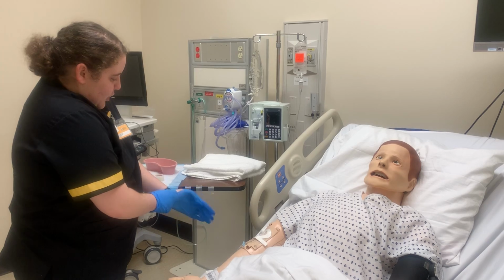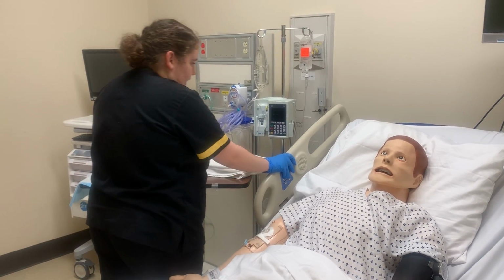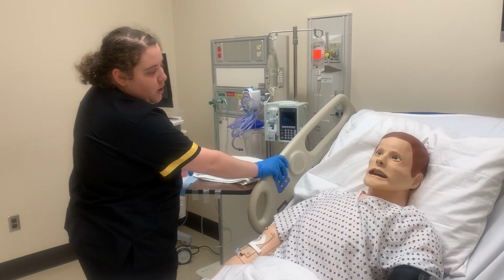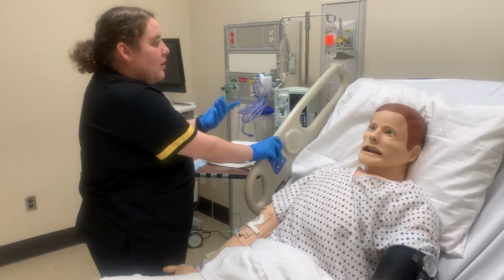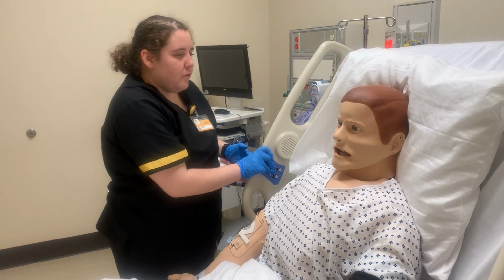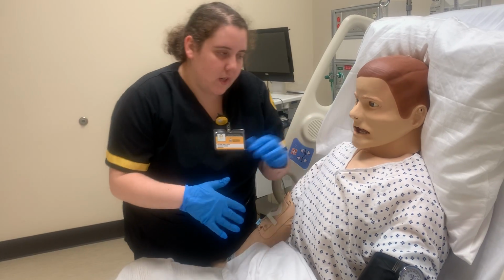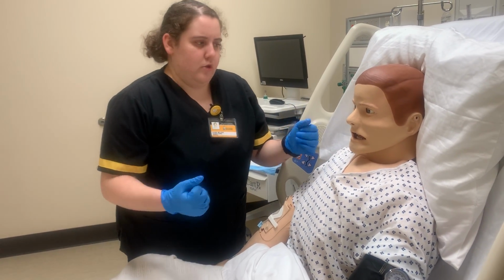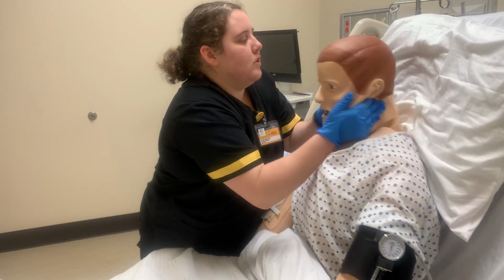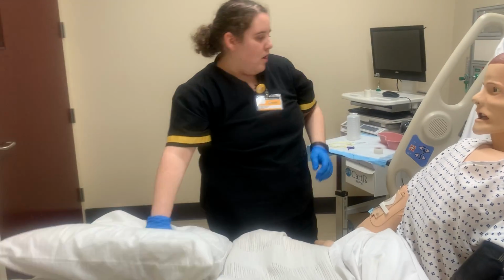Great. It is nice to meet you, Miss Tillman. So I'm going to quickly raise up your bed to a high Fowler's position, which is a 90-degree angle, and then I'm also going to remove the pillow. It will help make the procedure a little less painful for you, and it will also help me be able to get the tube down your throat correctly. That way it can get to your stomach safely. So let me just remove this pillow, and then we can go from there.